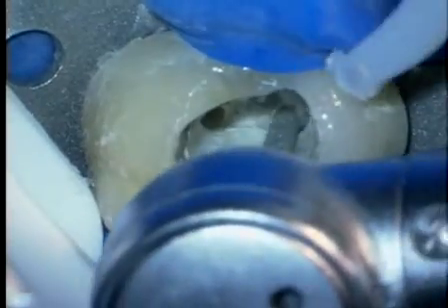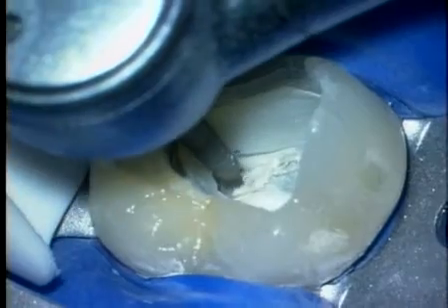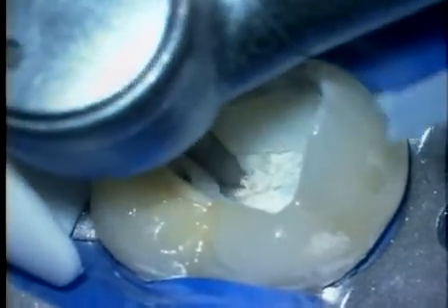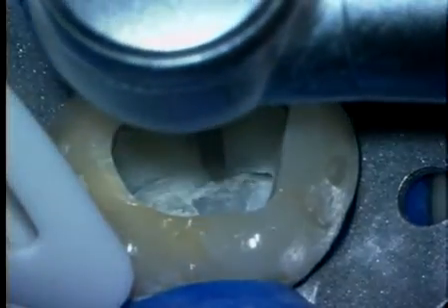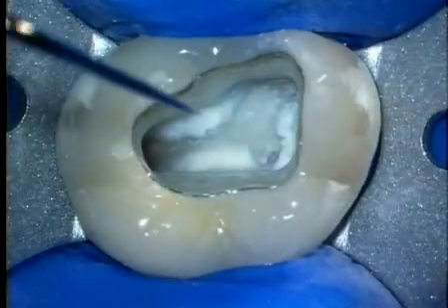Use the diamond like a piece of sandpaper. Lightly carry the diamond around these internal walls, just sanding away and refining until the axial walls become nice and flat. This refracts light and gives us excellent added vision into these deep pulp chambers.